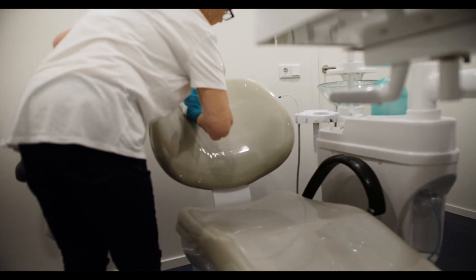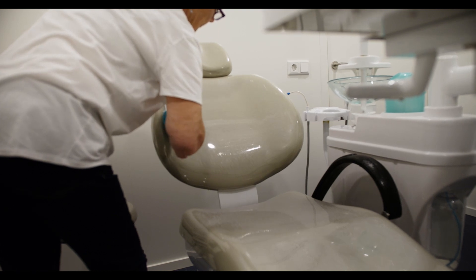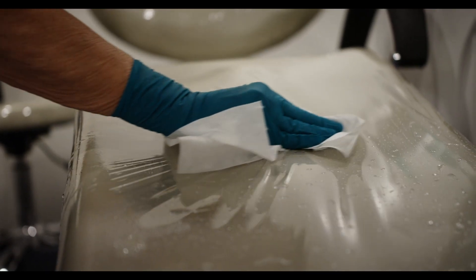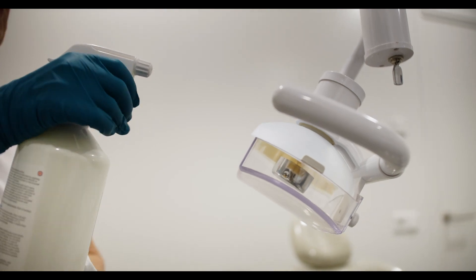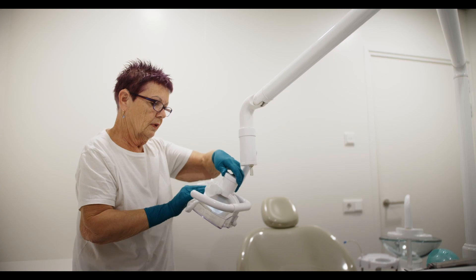LifeClean also leaves no residue or odor and ensures a swift turnover of patients. All surfaces can be sprayed and wiped, including the dental chair. Floor areas can be mopped with LifeClean solution, and mops can be left in a fresh solution to be decontaminated.